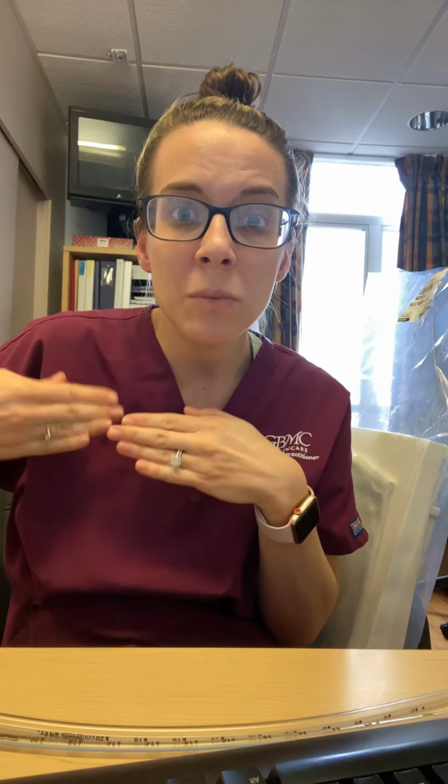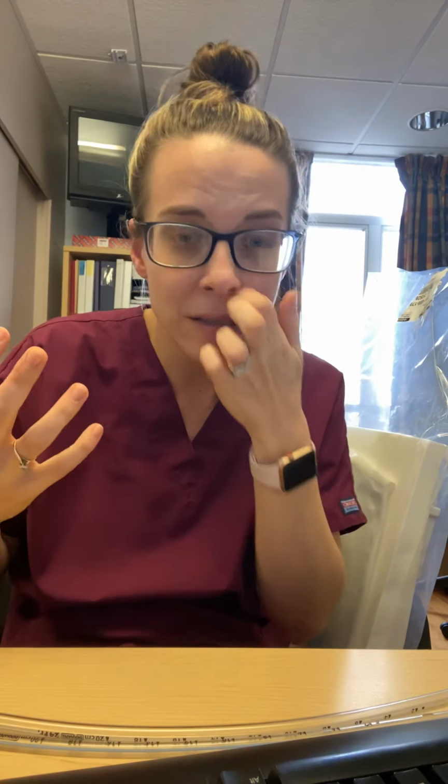So if you see bubbling in the water seal chamber, that means that if you took that chest tube out today and that lung is still leaking air into the pleural cavity, it's going to gradually build and build and build and start to collapse the lung and create a pneumothorax. So you would basically be removing the chest tube prematurely.